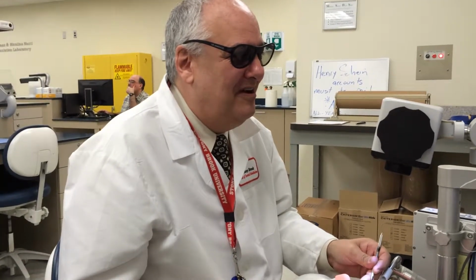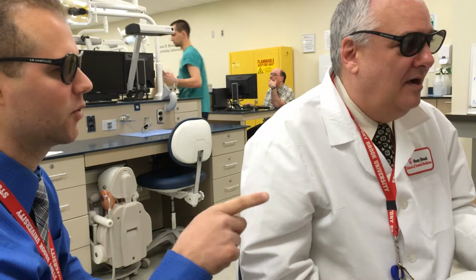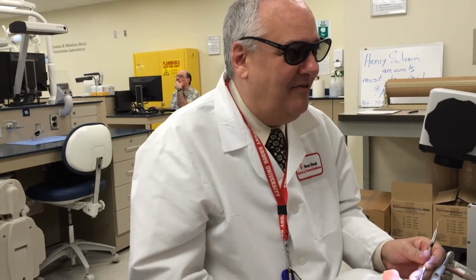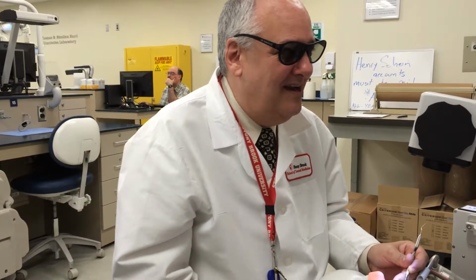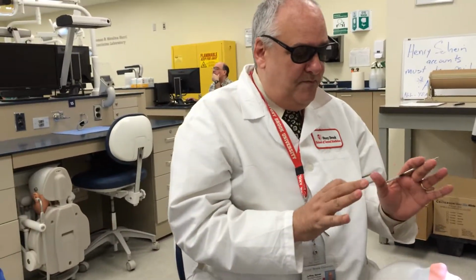You know, my mind did the same thing for about 30 seconds. It did. And I noticed it, but then I said to myself, I'm always accustomed looking through the microscope through indirect vision. And now I'm looking through a microscope with direct vision. That's what it is. Yes. Now look, now I'm fine. Now it's fine. As soon as you told me that, act like it's direct. Wow. The same exact thing happened to me.